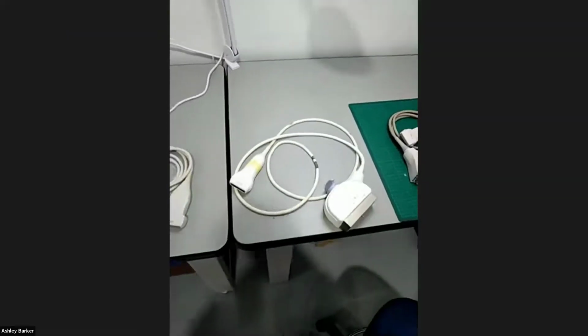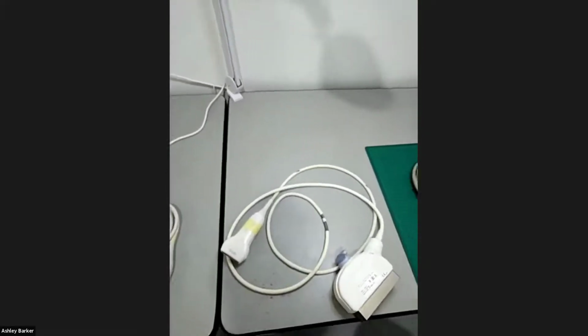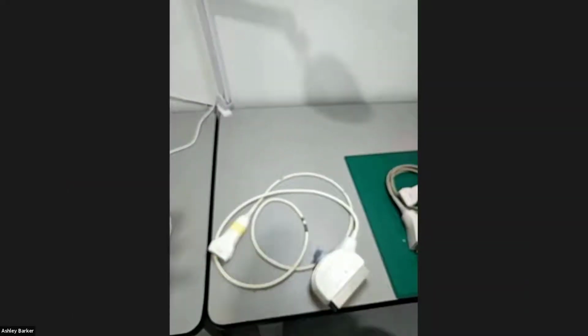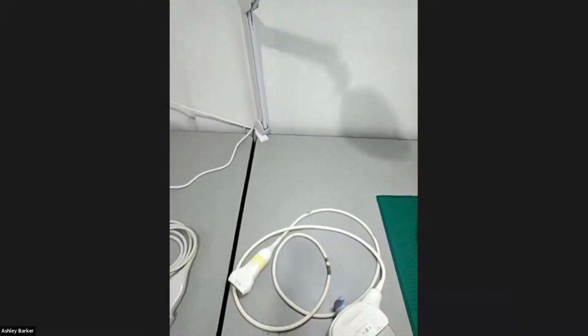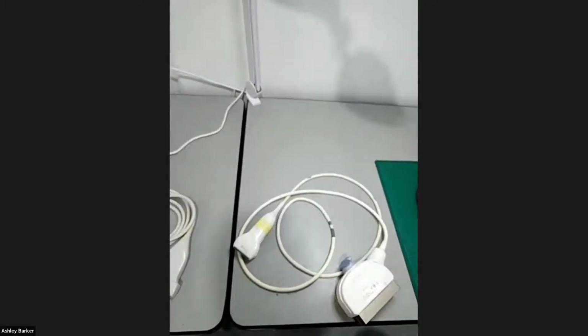I'm assuming that the wireless ones would have to be charged up separately, wouldn't they? So obviously you could be scanning and the thing goes dead on you, which isn't going to hopefully happen with a cord one. Yeah, they do have that problem. The battery life on them is normally quite spectacular, something like 8 or 9 hours. And they normally charge just by being in their probe holder on the machine. So you'd actually have to be doing 8 or 9 hours of full-time scanning, which most people aren't going to do. And they charge fast as well. You can pop the probe in and, 15 minutes later or something, it's charged. So they're reasonably well set up, but yeah, I guess they're expensive, and there are all those issues as well.